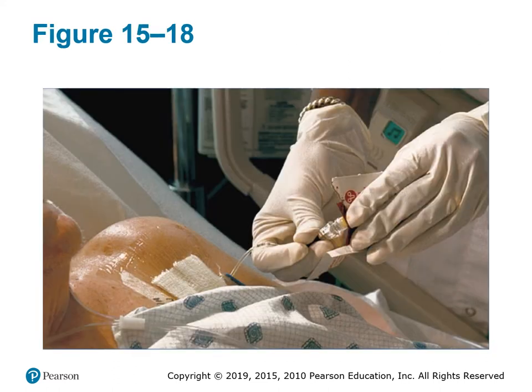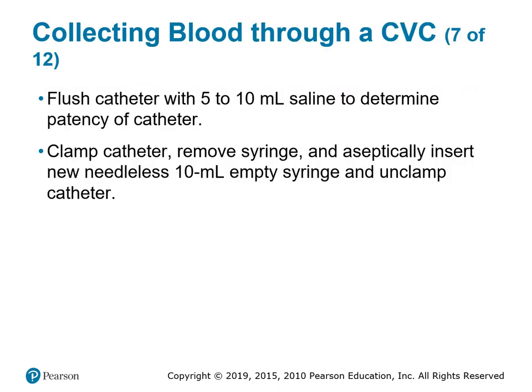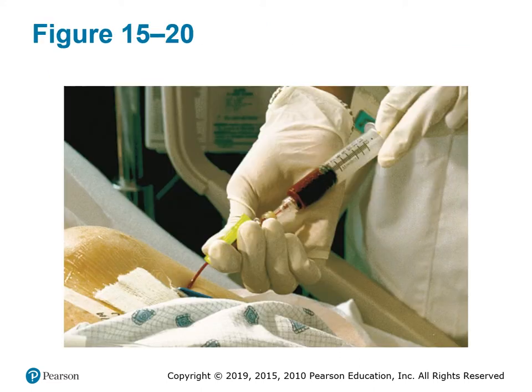That is there. Flushing a line with saline. Flush the catheter with 5 to 10 milliliters of saline to determine patency of the catheter. Clamp the catheter, remove the syringe and aseptically insert a new needleless cannula and 10 milliliter empty syringe, and unclamp the catheter. That is what they've done here. Now they're drawing the blood.